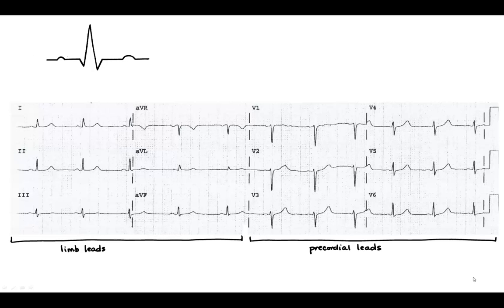So this might explain to you something about why our EKG tracing looks different from our textbook diagram. It's generally a lot longer, and that's because there are tracings that are accounting for each of the 12 different leads. But then you can look at this diagram and say, well, the squiggly black line I'm seeing doesn't really follow the pattern that I'm seeing here from the textbook diagram. And what I'd like to show you is that for some of the leads, it actually does follow that pattern.